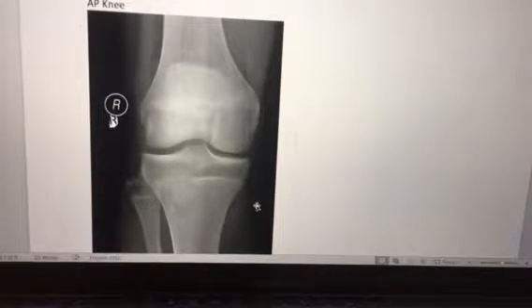So my criteria would be: the knee would be fully extended if the patient's condition permits. You want your knee without rotation, femoral condyles symmetric, and tibia intercondylar eminence centered. You want slight superimposition of the fibular head and the tibia.